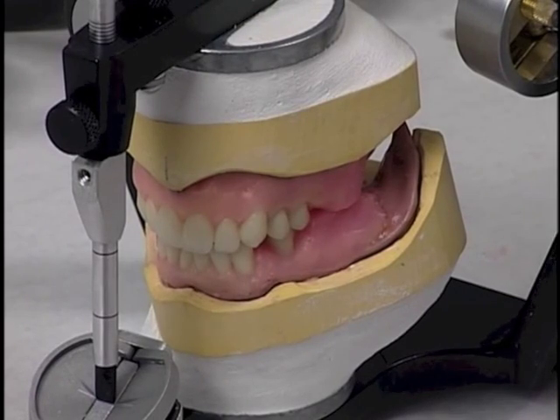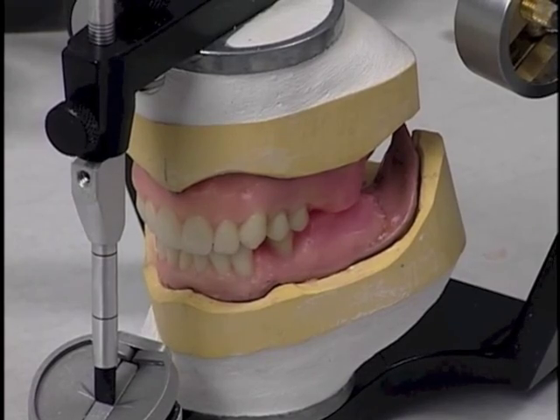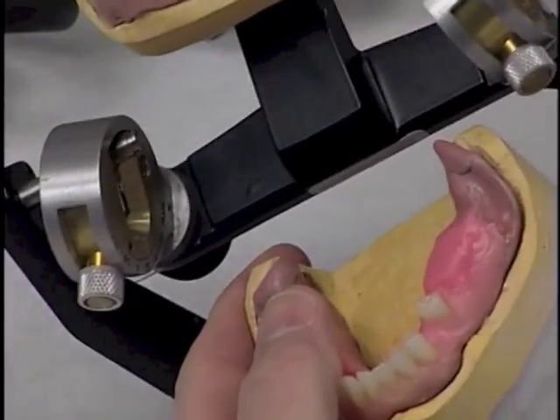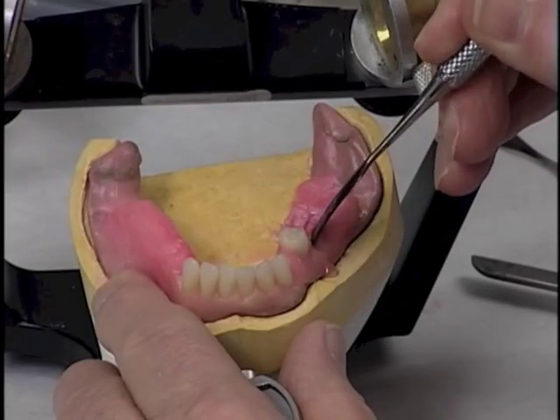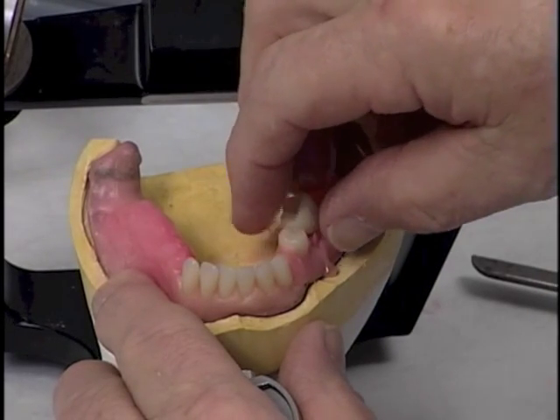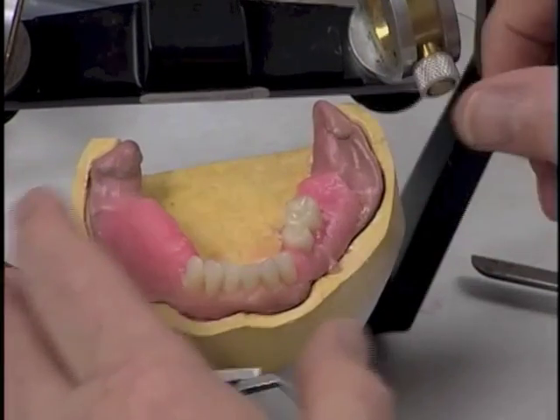I'm going to remove some wax now from the area where these molars belong. And place the tooth now with the central groove over the crest of the ridge.